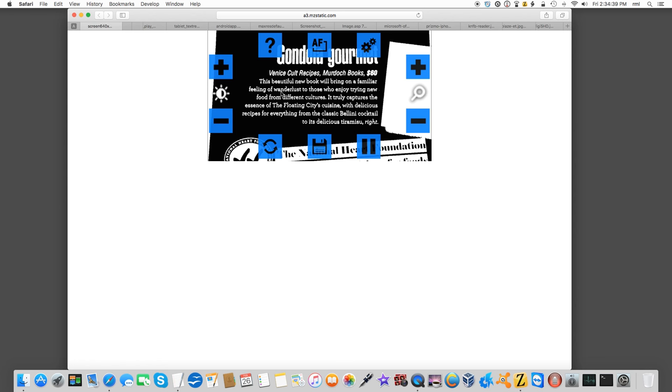This is Vision Assist. Vision Assist is a video magnifier. It allows me to adjust the colors. You can see here we've got white text and a black background. It allows me to adjust the magnification level, focusing, flash. It allows me to pause the image and zoom around it.